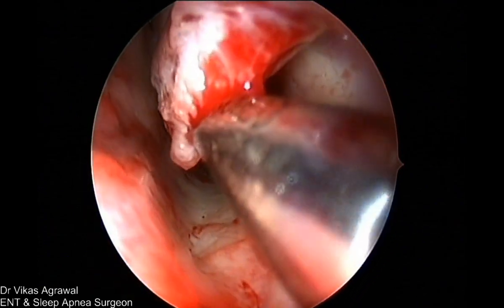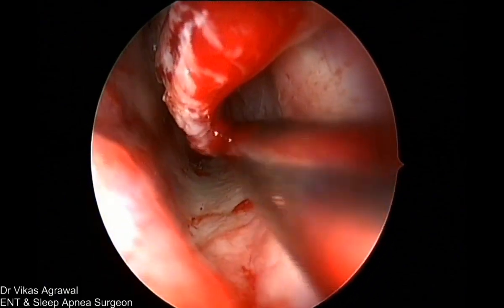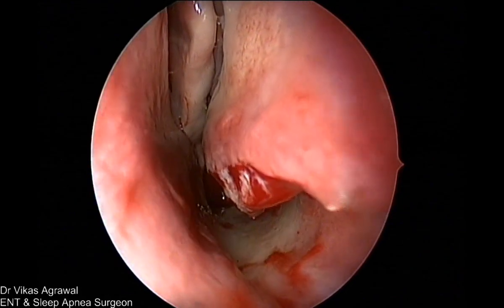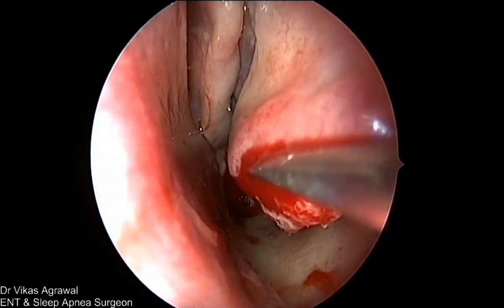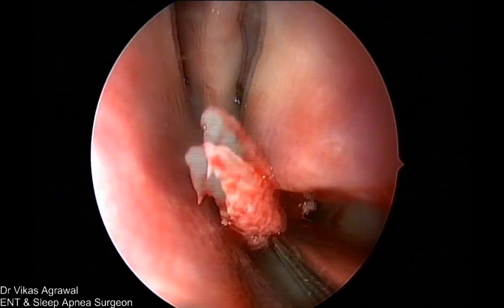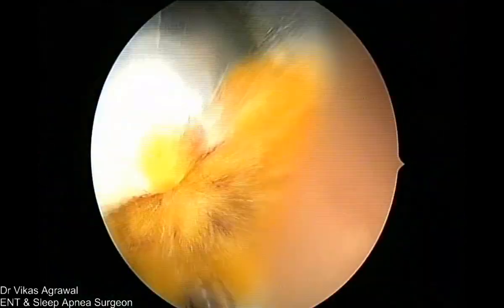So if required, you can outfracture the turbinate, remove the mucosa, because the mucosa is on the lower edge. I'm just showing, I'm not removing. If required, you can just cut away this bone like this. Here it's not big, so I'll just demonstrate that you can cut a small part of the bone like this. If the bone is very big, you can remove this part of the bone. You save all the mucosa which is useful.